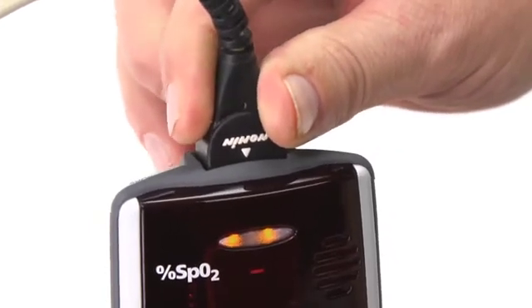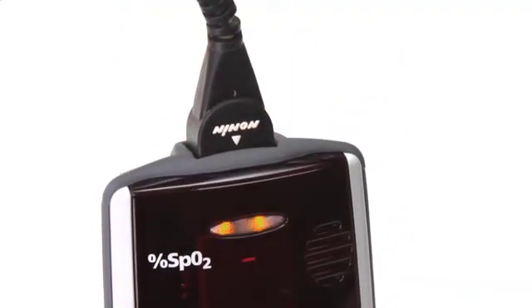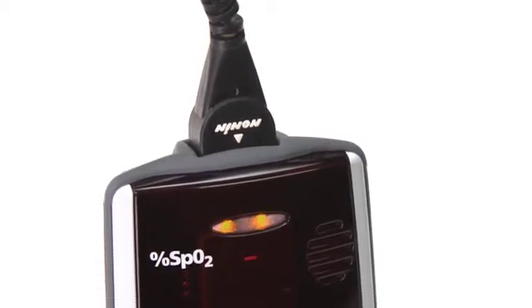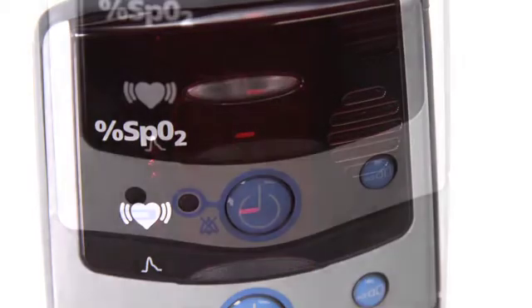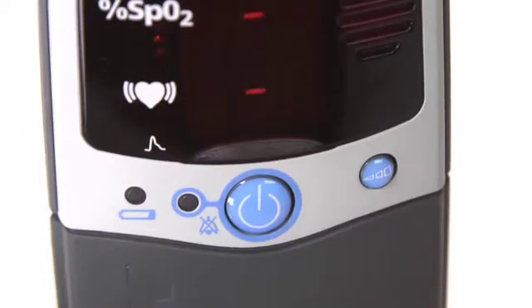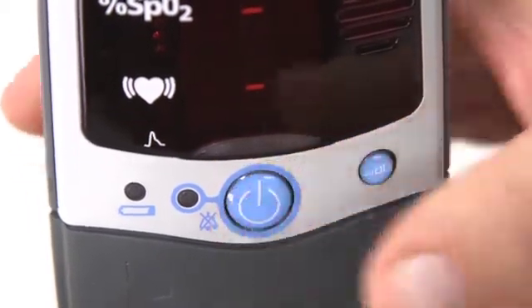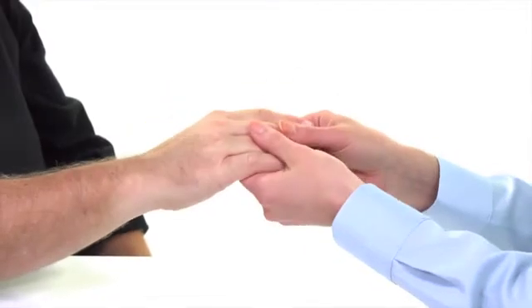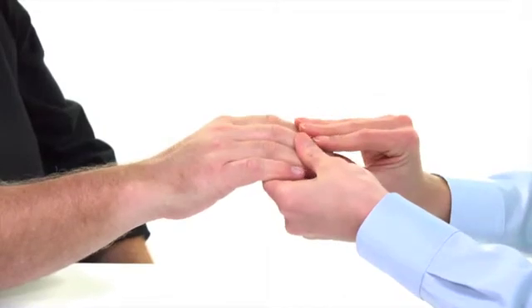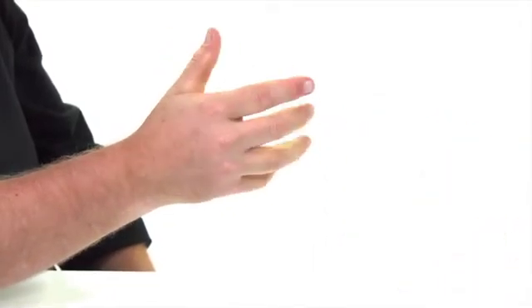Signal loss from the sensor is possible with hand or body movement, disconnection of the cable, or body position and cold conditions that may reduce blood flow. The audible alarm will sound a 3-beep alarm every 25 seconds, and a dash will appear between the pulse and oxygen level displays. You can silence and restore the alarm with the press of the on/off button. Check and correct the position of the sensor if it has moved, and recheck the sensor connection to the oximeter. If the hand has been grasping a rail or other object, or it is cold, relax and warm the hand to restore stronger blood flow.